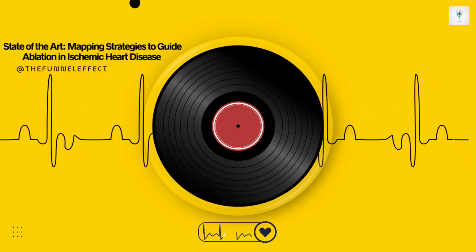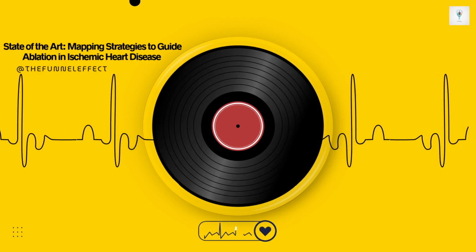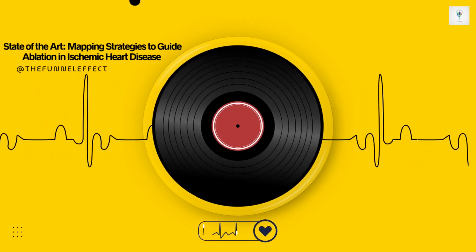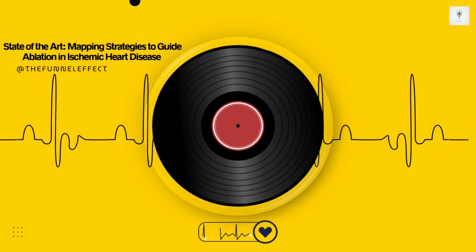This lack of specificity pushed researchers to look for more distinct EGM features. And that brings us to fractionation, looking for more complex signal shapes. Exactly. Researchers like Andreu started focusing on highly fractionated electrograms, EGMs.